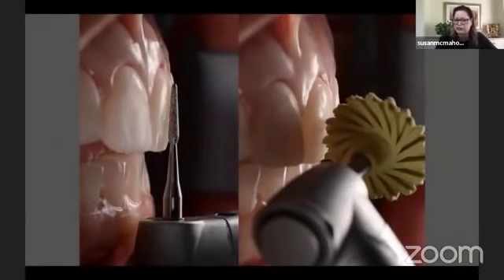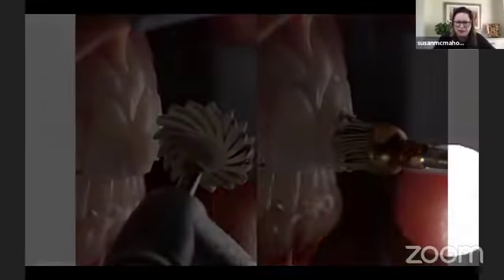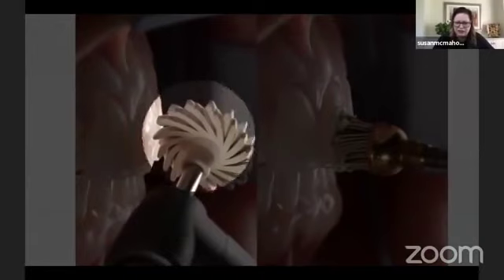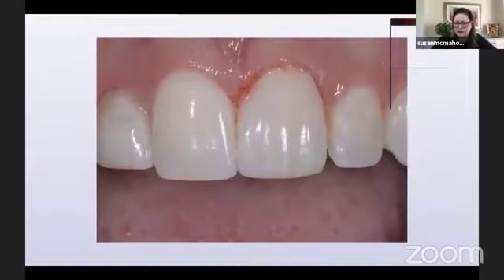And this one is Jiffy's Universal from UltraDent. And they're my absolute favorites. And we're going to take it across the surface a couple of times, really just a couple of times. And I have a video in a minute. And then we take the fine polisher across the surface a couple of times too. And depending on your composite, you may or may not need diamond paste afterward. There's a couple of composites like Mosaic. I don't even need the diamond paste. It polishes so high.